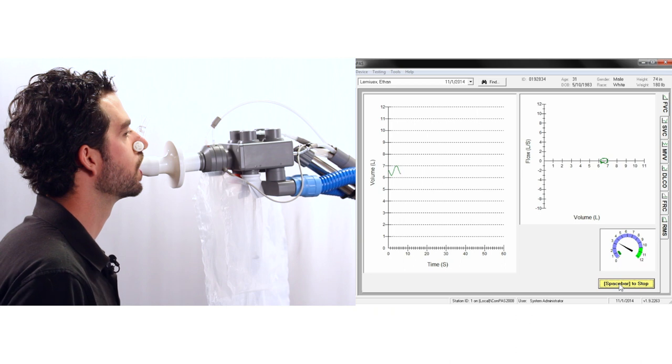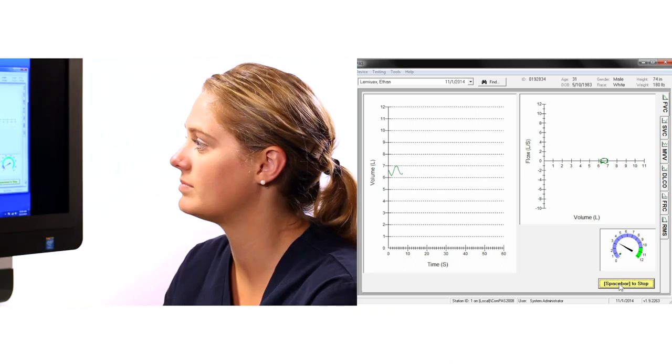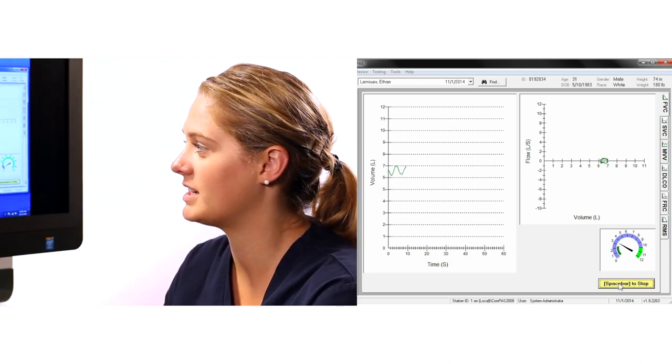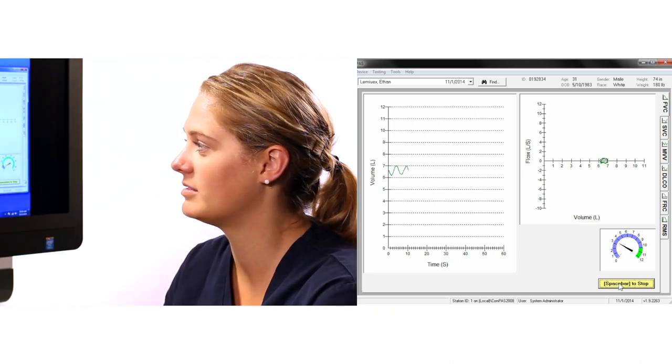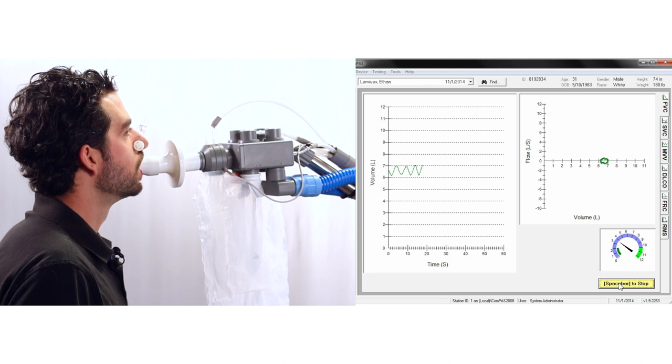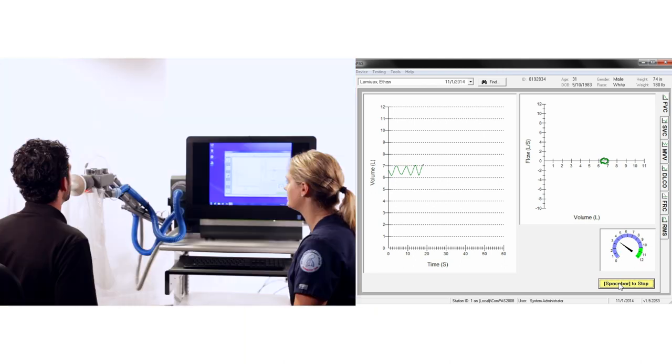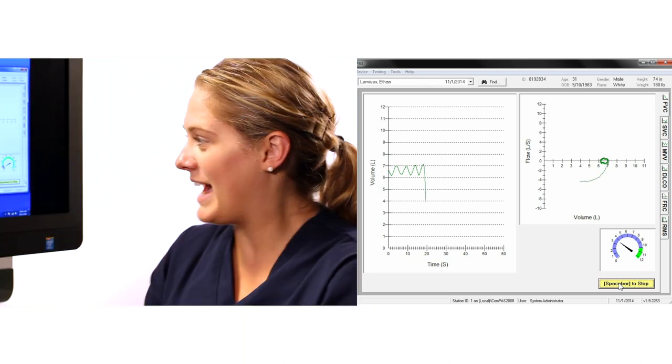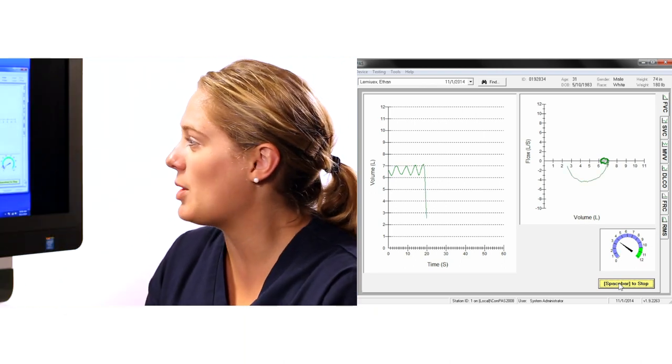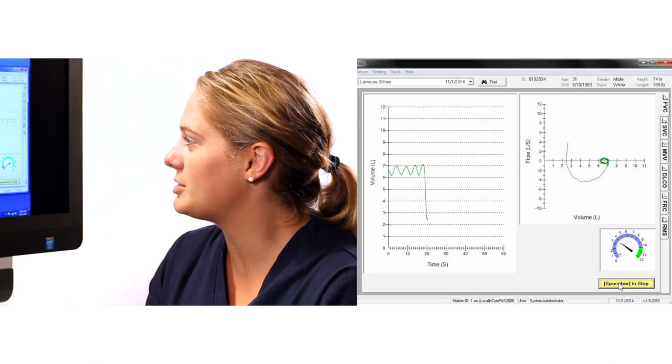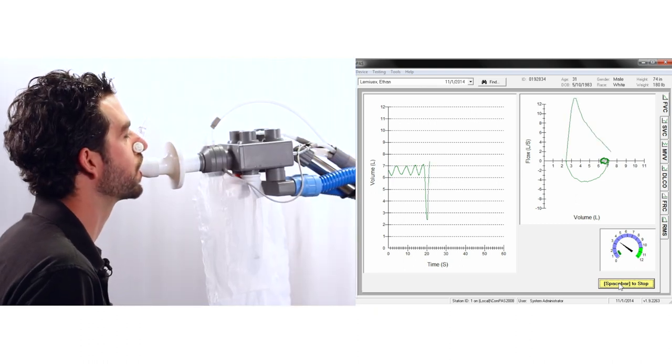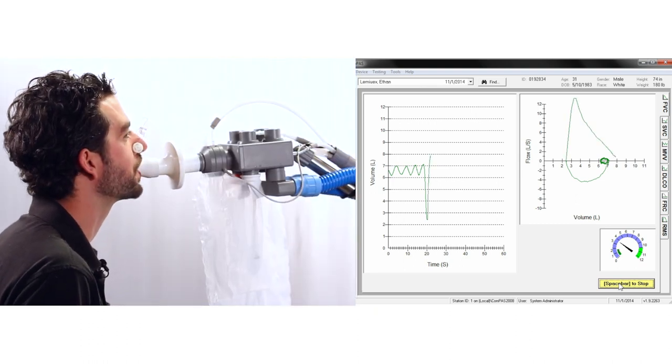ask the patient to take a deep breath in as far as you can, make sure they are fully inflated, then encourage them to blast the air out as hard and fast as you can and keep the effort going until you are completely empty.